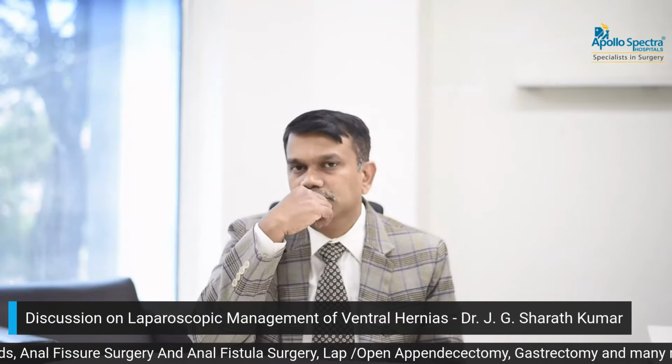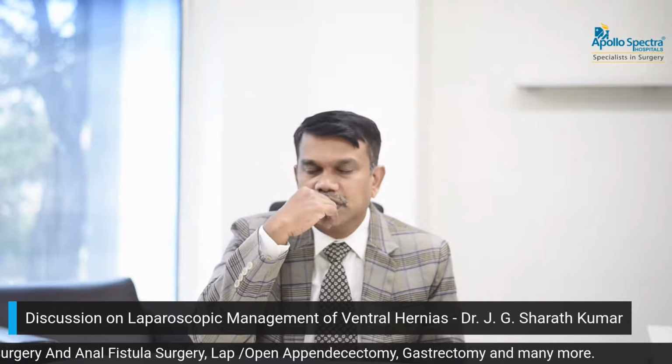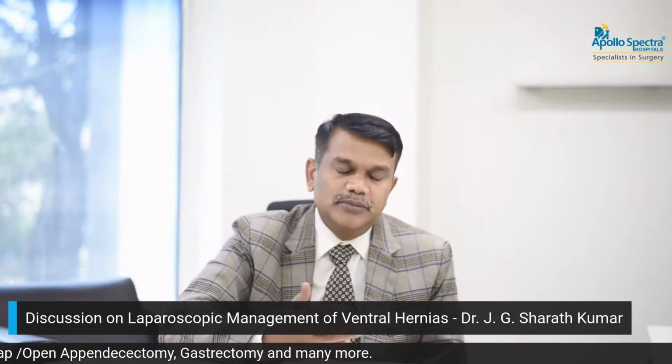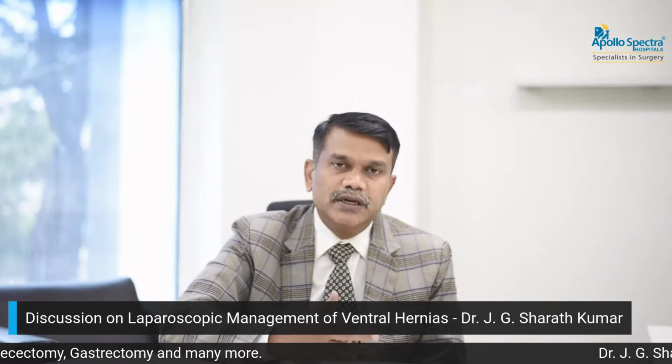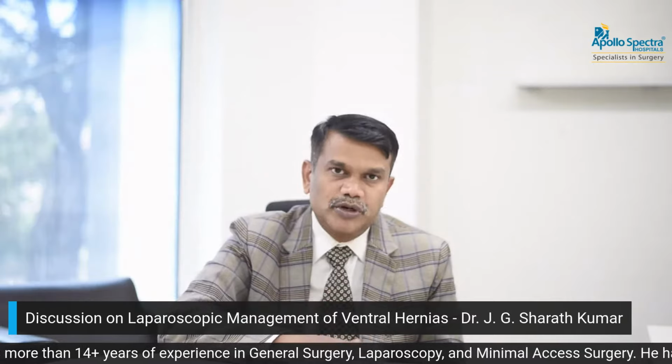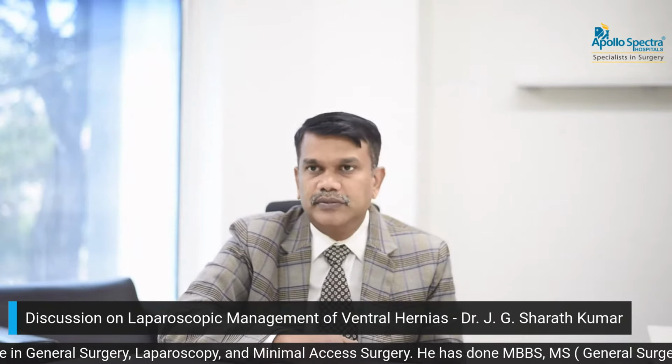Why IPOM plus only, doctor? We can use other techniques also. Because IPOM plus closes the defect, there will be less chances of seroma formation, less eventration. The movement or migration of the mesh into the defect, that may cause, that's called eventration. And there will be less chance of recurrence and better restoration of the abdominal wall function. So we can keep the mesh properly, and low morbidity, less wound infection.